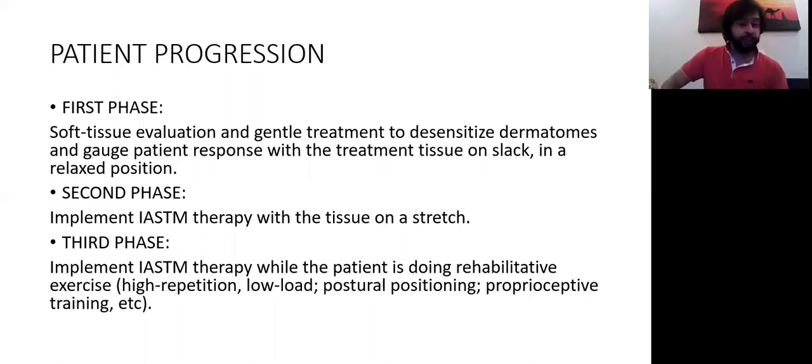You are the right person to judge which phase he is in, and then choose the progression accordingly. You can use it while doing lunges, you can use it while doing isometrics. So you can use an IASTM tool in closed kinematic chain exercises and in open kinematic chain exercises. If you feel there are issues over there, choose the treatment accordingly.